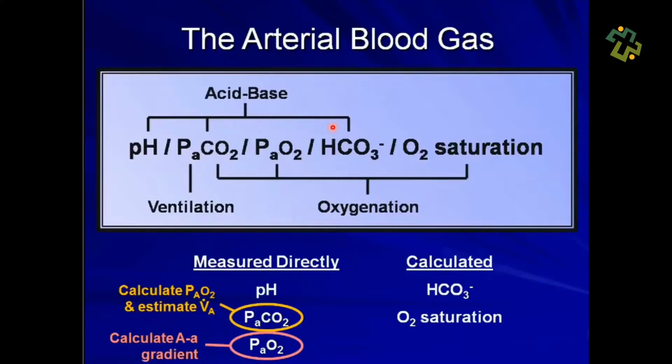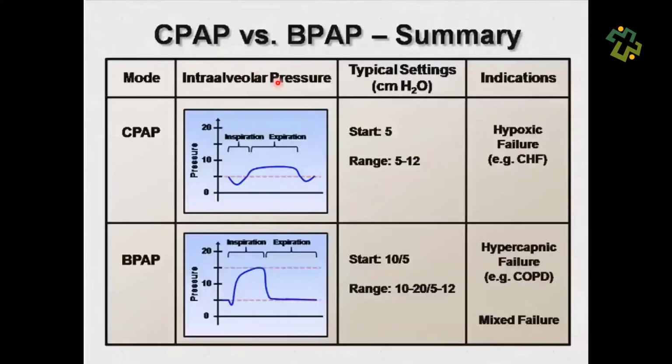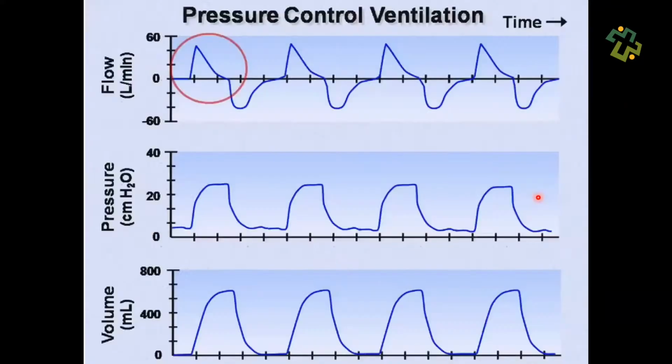Then, of course, this is taken from gas exchange to understand arterial blood gas and ventilation and oxygenation, two very important but parallel different processes and how to monitor these. Okay, and this is taken from the non-invasive vent section, talking about CPAP and BiPAP and typical settings and what are the indications, where would you use it, when would it be unsuccessful and you have to opt to go on to intubate the patient.